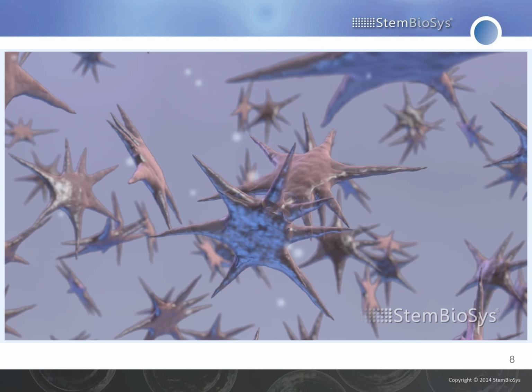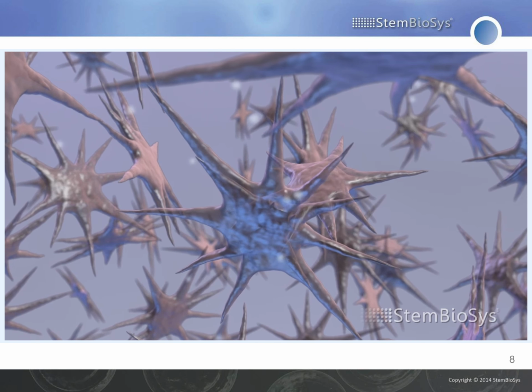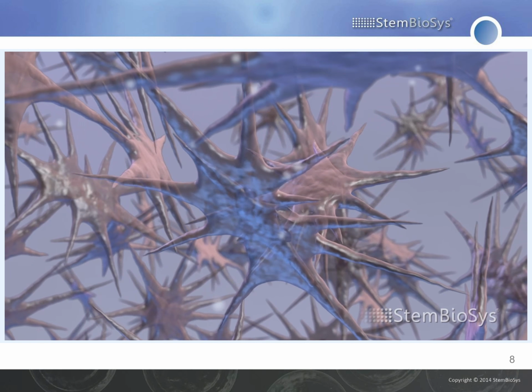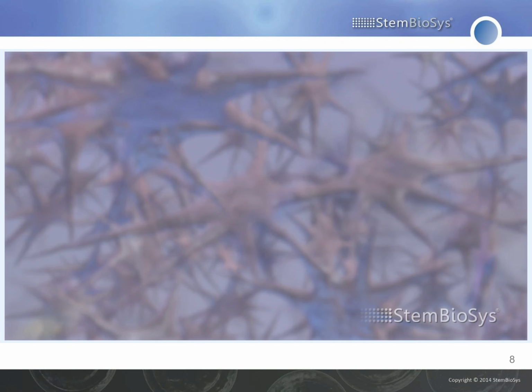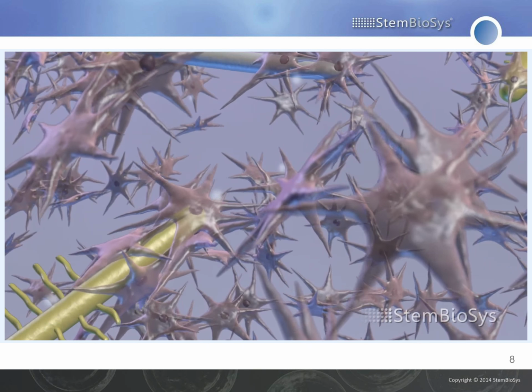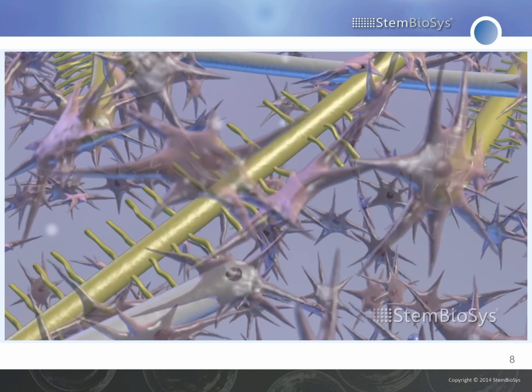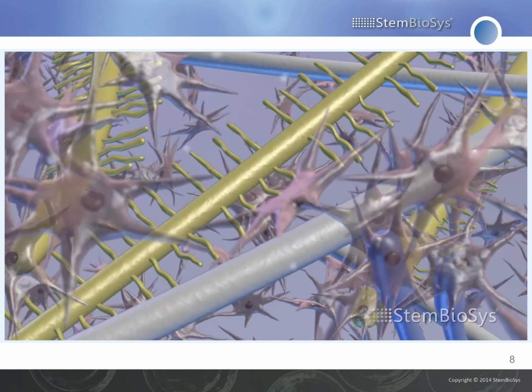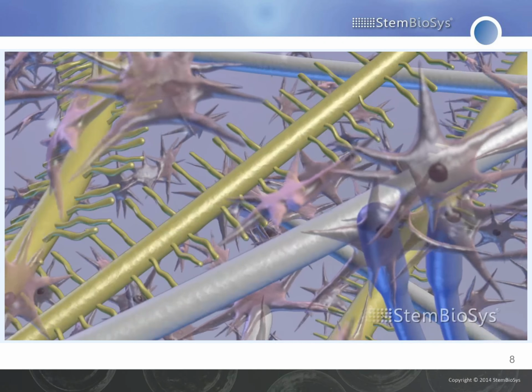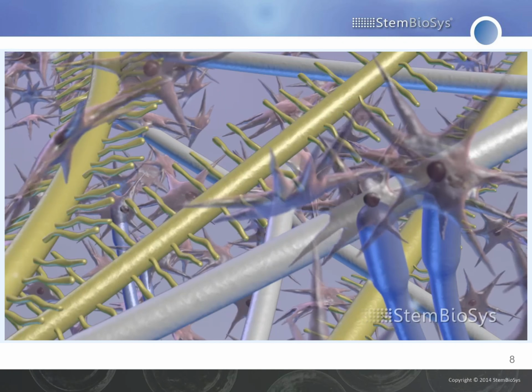These cells, along with a custom cell culture medium, are then added to a standard cell culture dish. The cells begin to divide, thereby increasing cell numbers and fully covering the surface of the cell culture dish or substrate. The cells are then stimulated to produce an extracellular matrix. These matrix proteins are deposited in a defined and ordered three-dimensional structure, a home built by the bone marrow cells in a fashion similar to what they do in their native bone marrow.